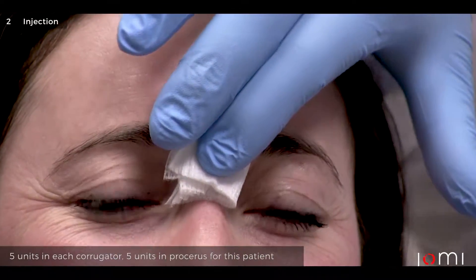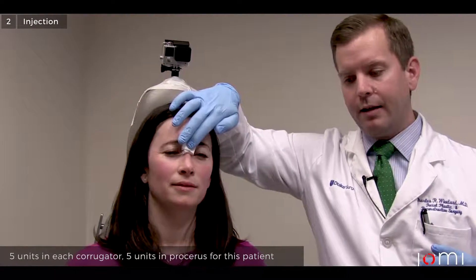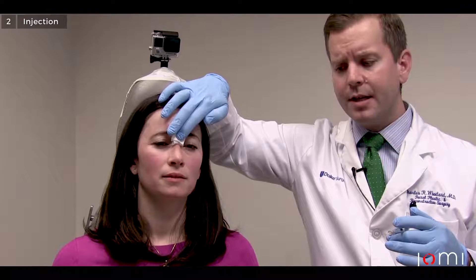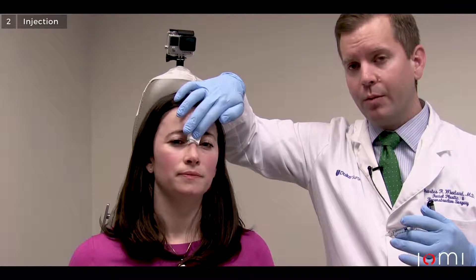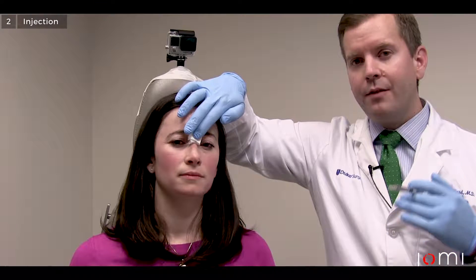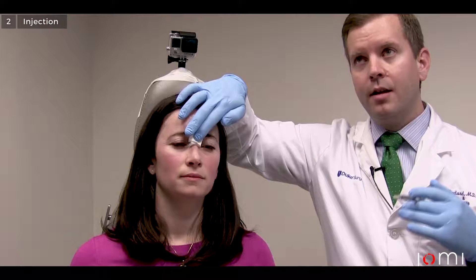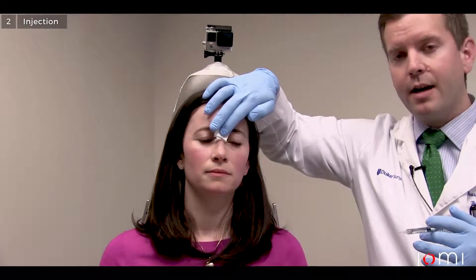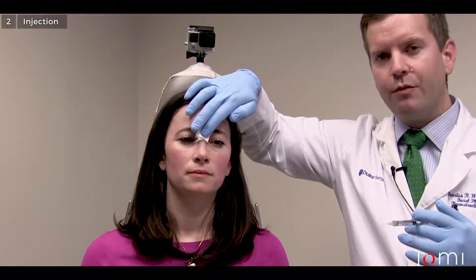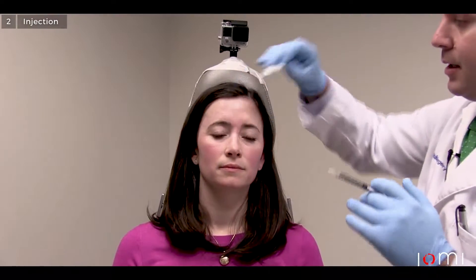Apply pressure there for just a second, let her catch her breath, and then we'll treat in the lateral orbicularis oculi region. I tend to do injections in 2.5-unit aliquots on the lateral aspect of the orbit. It's important to note that in the orbital skin, deep to the skin you're going to find the muscle — there's no subcutaneous tissue there, so you're going to raise a wheal, similar to what you would for a TB test. You're going to want to stay very superficial in the skin when addressing this area.